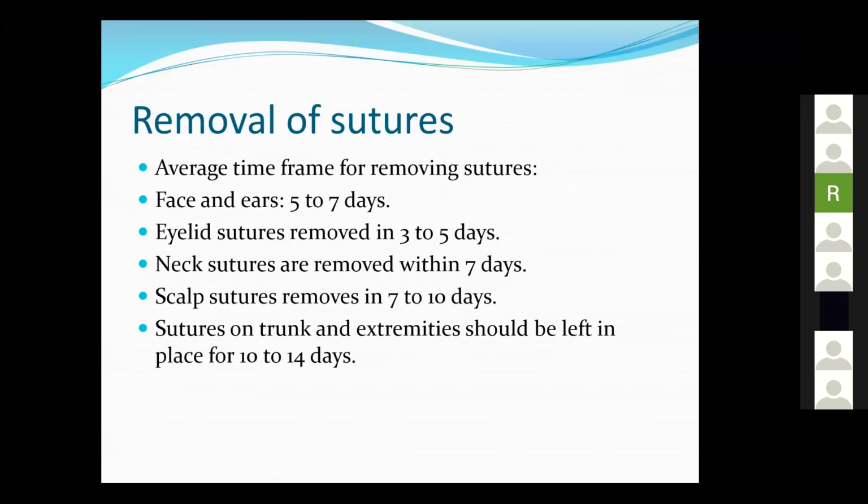Like in olden days, I keep remembering the suture material used was silk. It causes severe tissue reaction. We use Prolene to fix our drains now on the skin. Prolene is the favorite suture material for skin closures, and we remove them in 7 to 10 days' time. If we leave them longer, the knot sometimes can cause reaction.